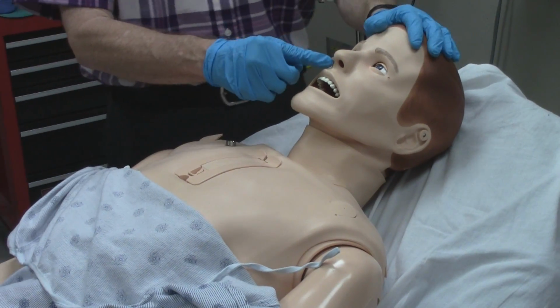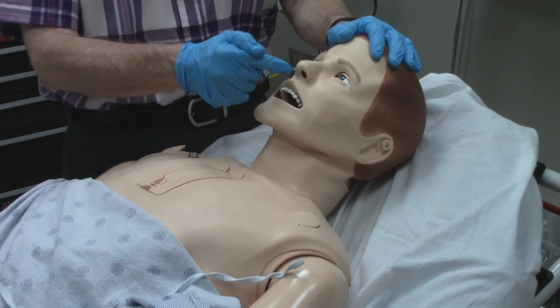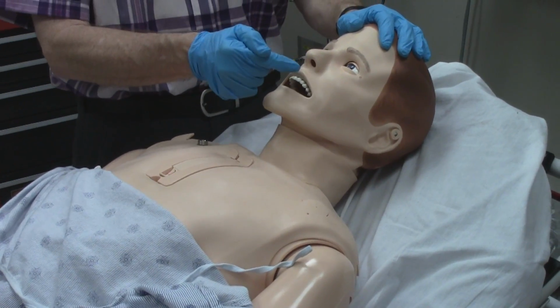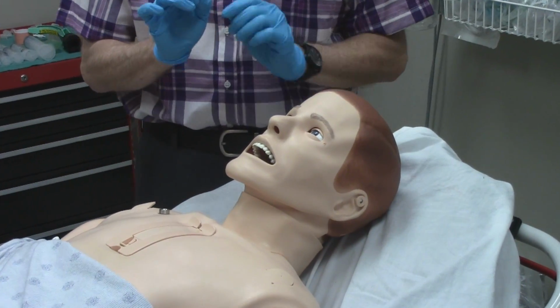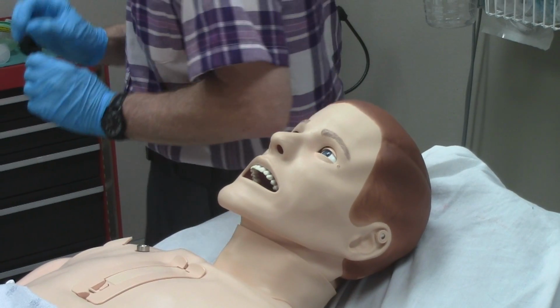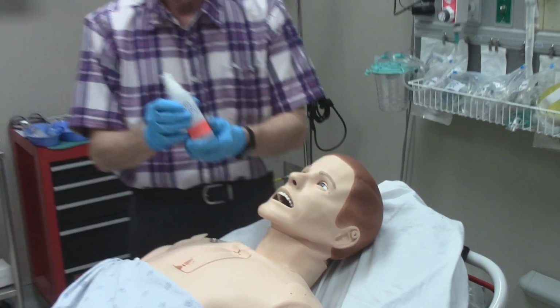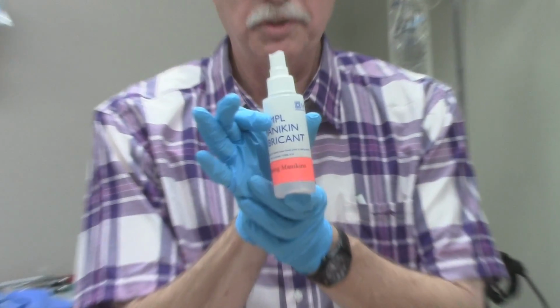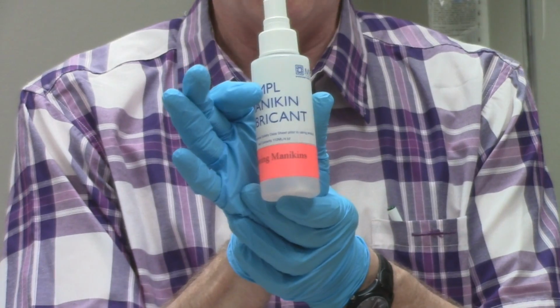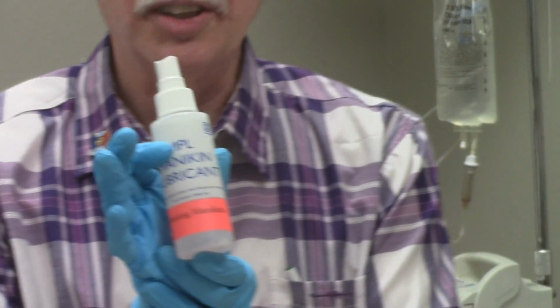The SimMan also will take a nasogastric tube. A nasogastric tube can be inserted through either of the patient's nostrils. Anytime you insert any type of tube into one of these mannequins, please use the Laerdal mannequin lubricant that you'll find in the room. This is simply glycerin and water that will make the tubes slide a little bit more easily into the mannequin.